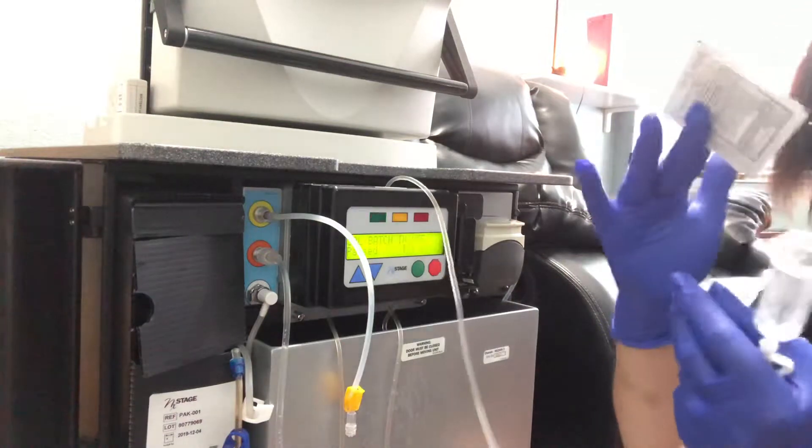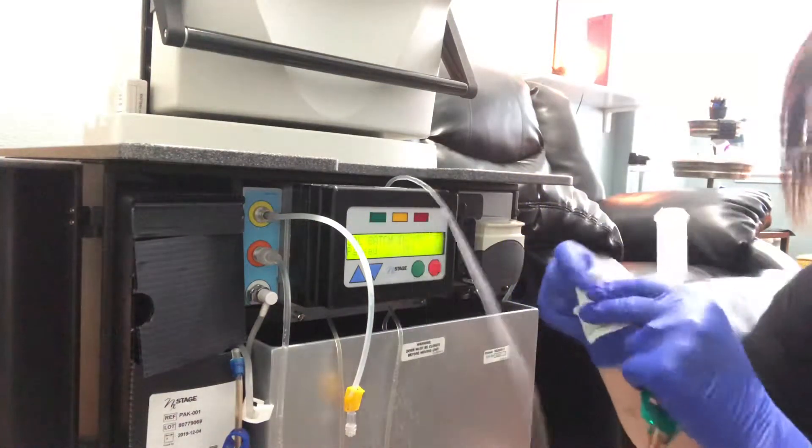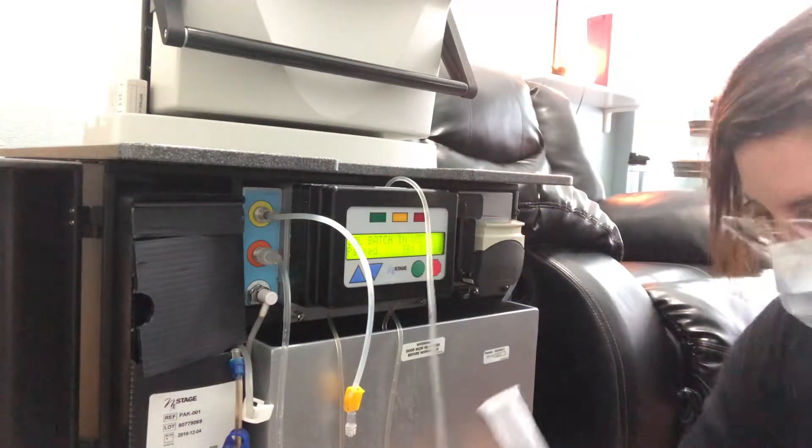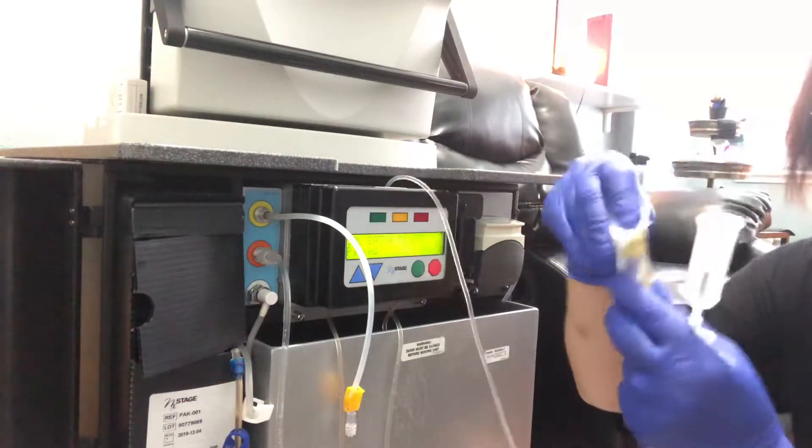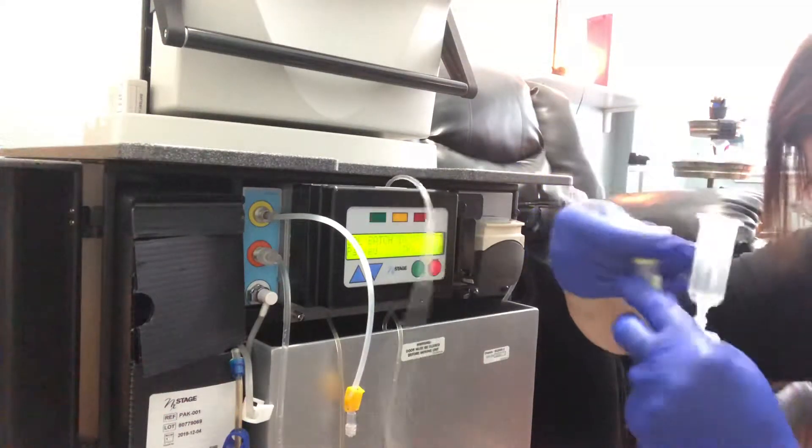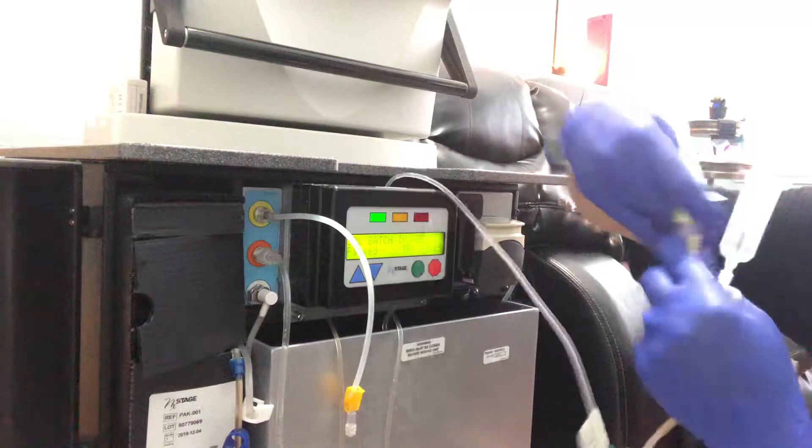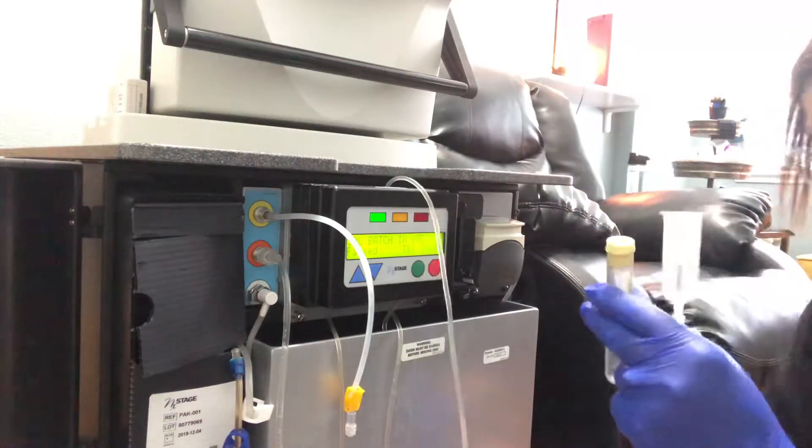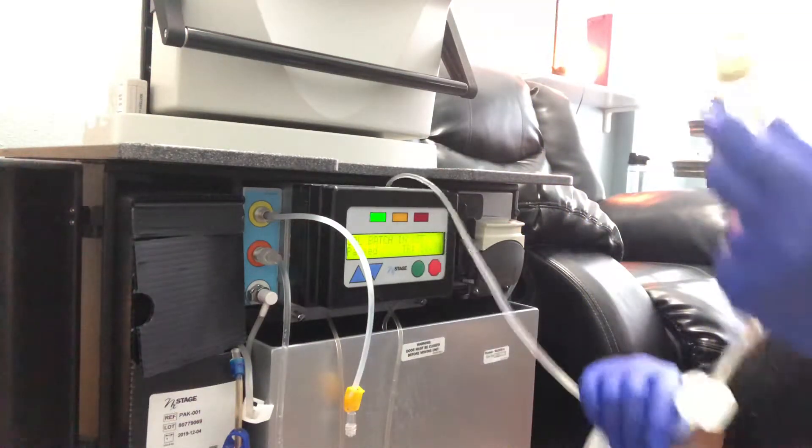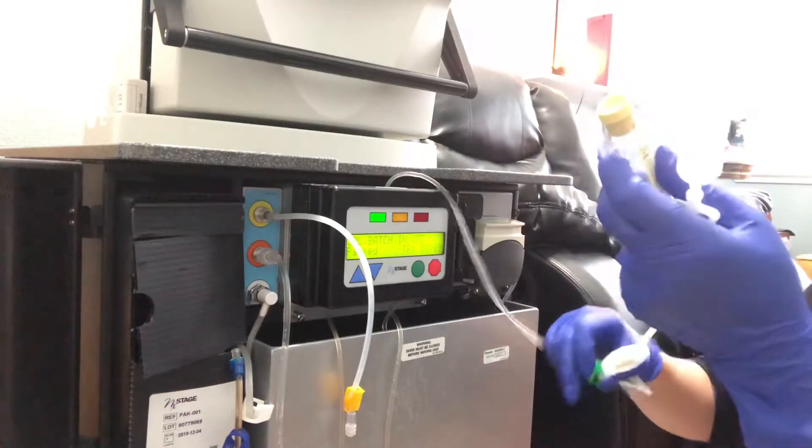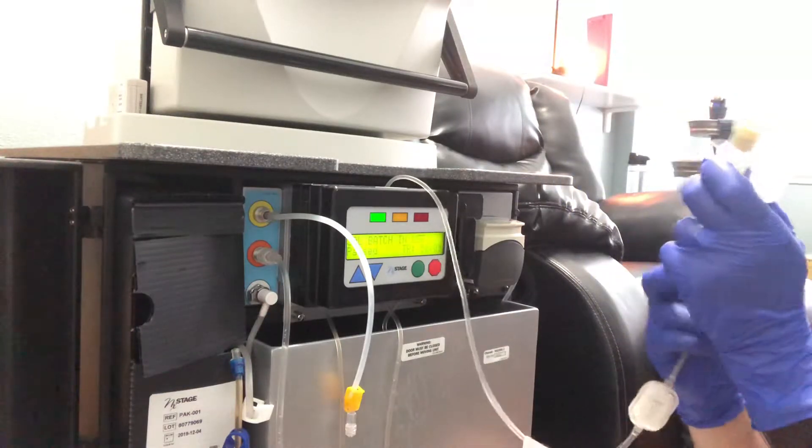Now I'm going to take the alcohol pad and I am going to clean the top of this, back the little test tube holder. I'm going to unclamp, make sure that we're unclamped.